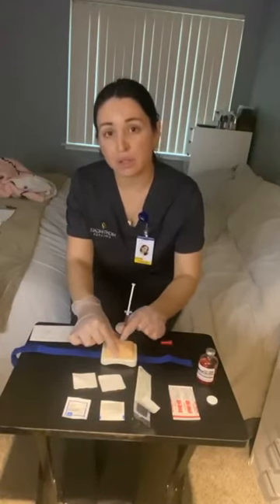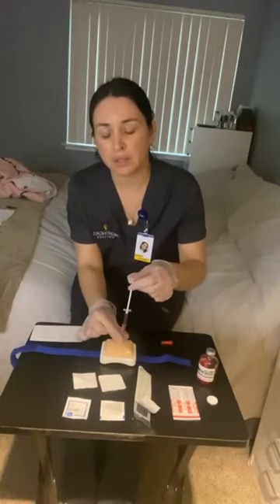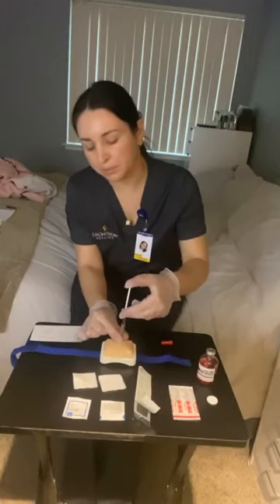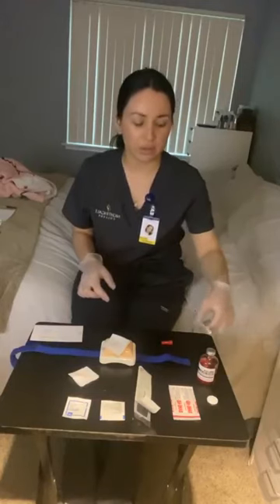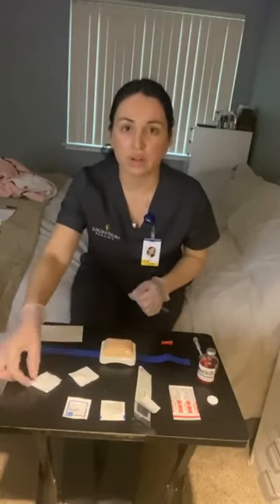Next, I want to use my non-dominant hand to place it at the end of the syringe and use my dominant hand to inject over several seconds. At the same time that I'm removing quickly, I want to grab gauze and take the needle out. I would place it in the sharps container. I would discard that in the trash.